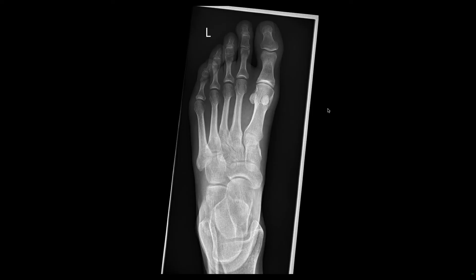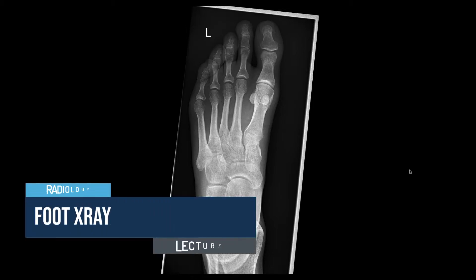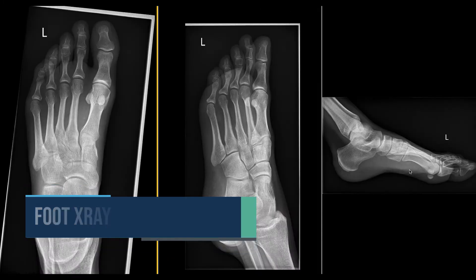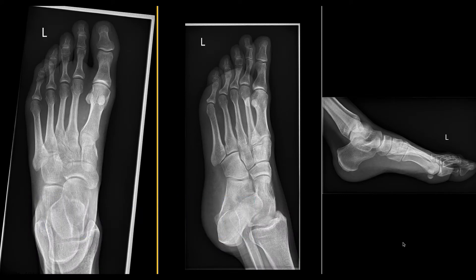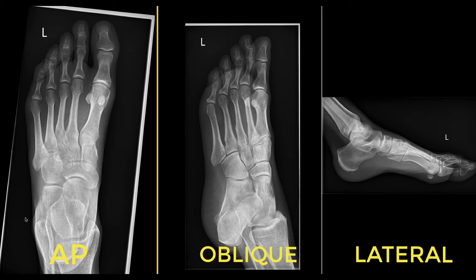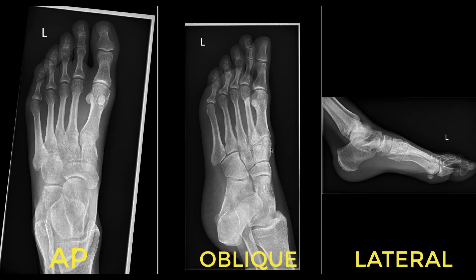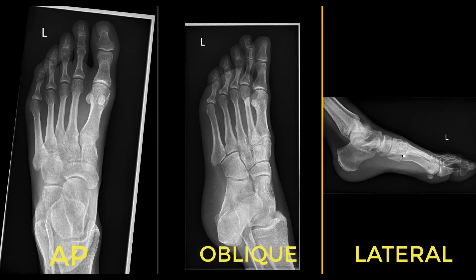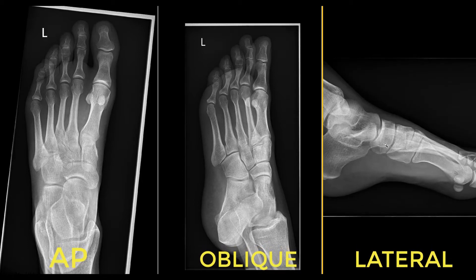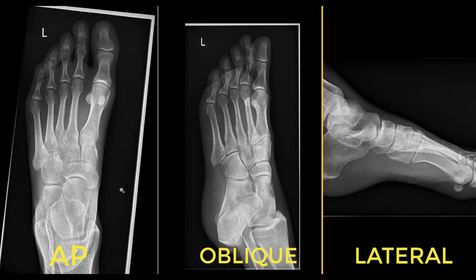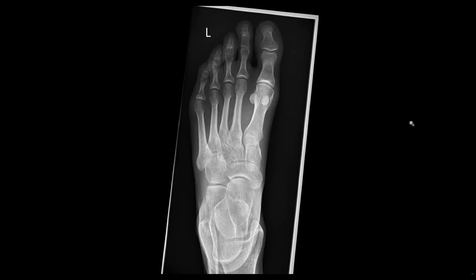We're going to look at a foot X-ray today. The first thing to know are the views. There are three views for the foot X-ray: the AP view on the left, the oblique view in the middle, and the lateral view. So AP, oblique, and lateral — these are the first things you should know.